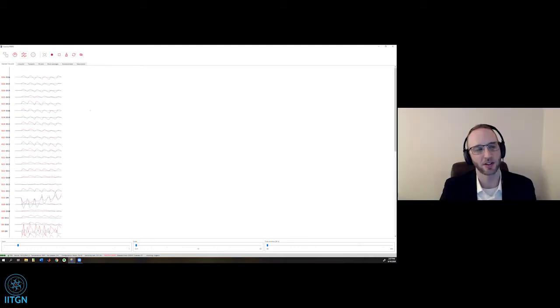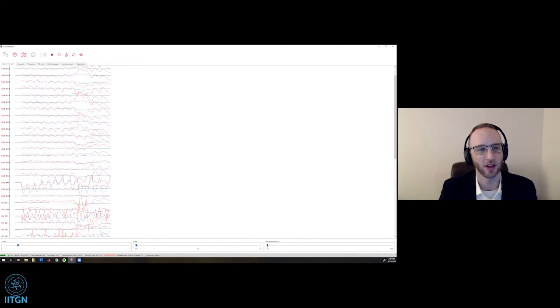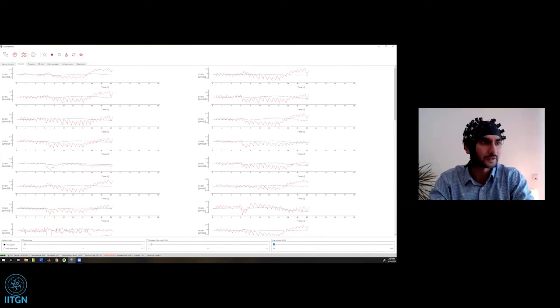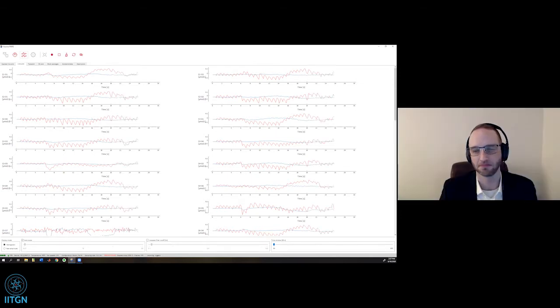And Mahipal, I just wanted to mention also that we do have whole head systems as well. So you can cover the entire head, even with very high resolution coverage. Absolutely. And this is to give you a very brief, rough idea.